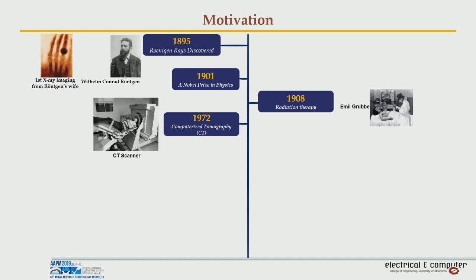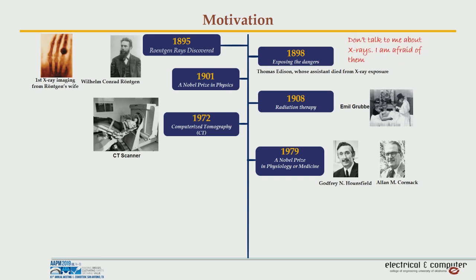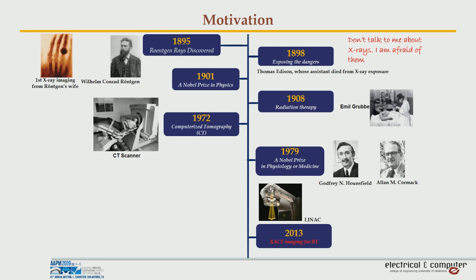So we proposed X-ACT imaging. By the way, the biggest concern of X-ray imaging is that it involves ionizing radiation, and patients are scared about radiation. So how to reduce radiation dose is always a big concern. In 2013, we proposed that X-ACT imaging could visualize the radiation beam and do radiation therapy more precisely.